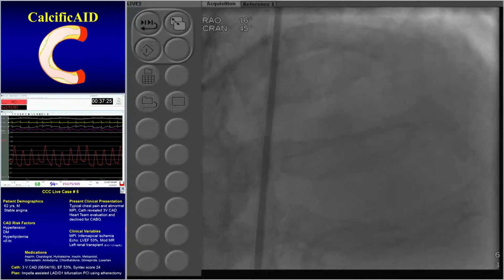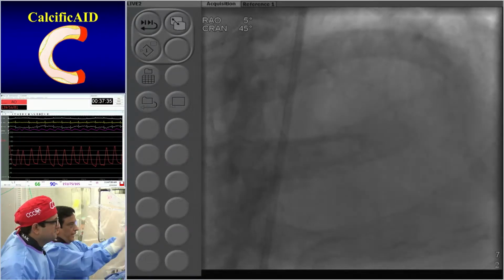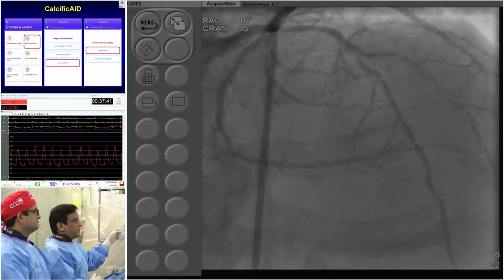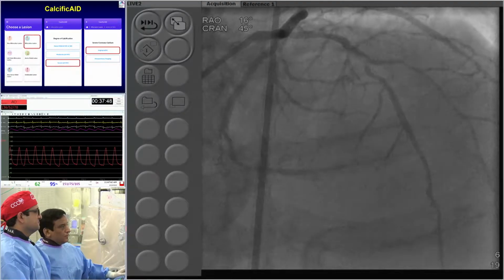Before you go to the picture, I always tell you, in order to see calcium, you do the cine run. You see here the entire ghost of the vessel. You don't need IVUS, you don't need OCT. Angiofluoro clearly tells you severe calcium with a tram track. This patient has diffuse disease of the angulated LAD, and again long disease of the diagonal. So that's where we are.